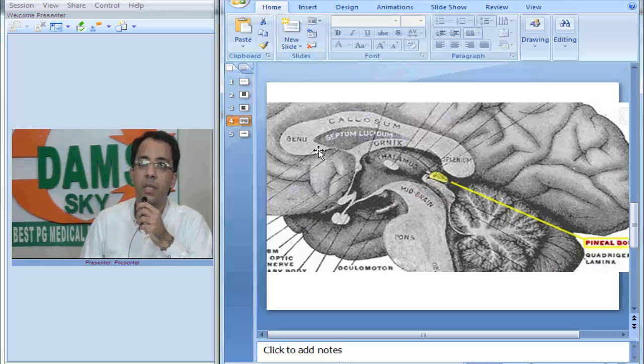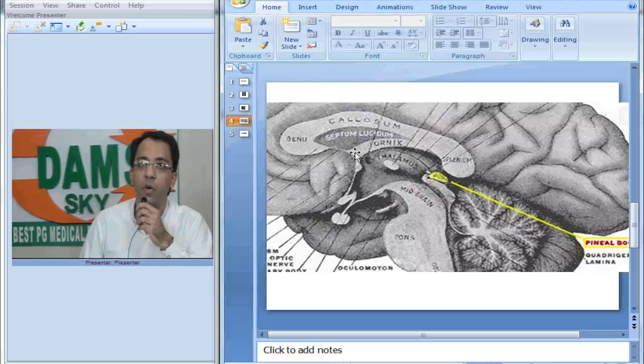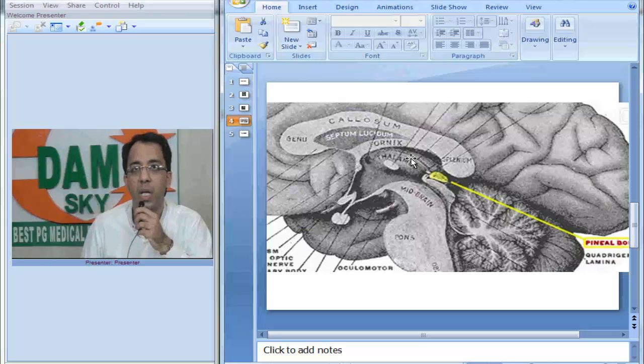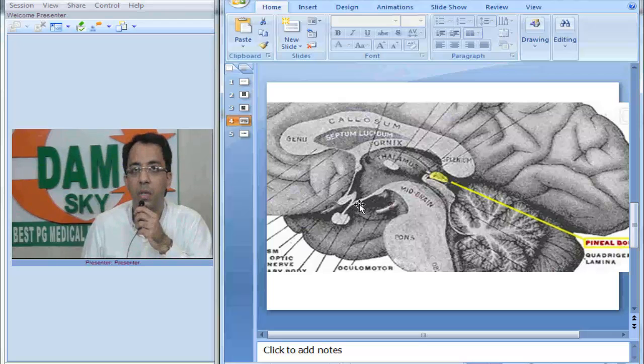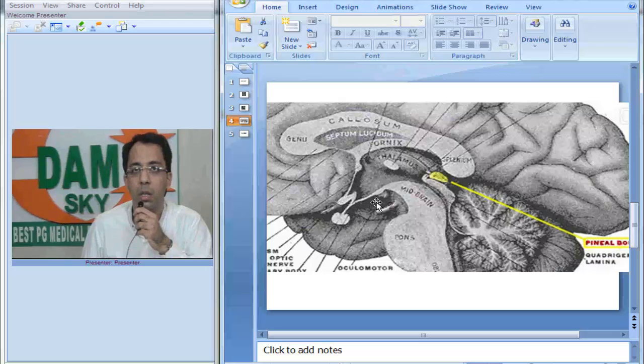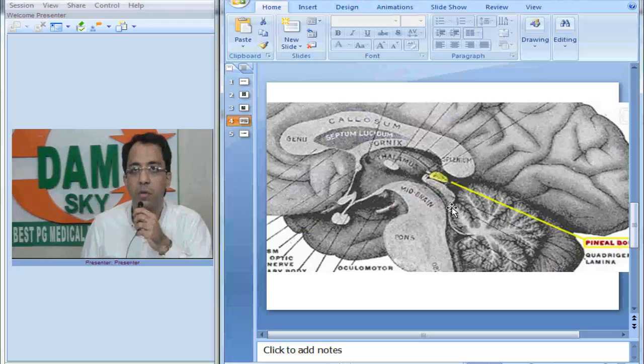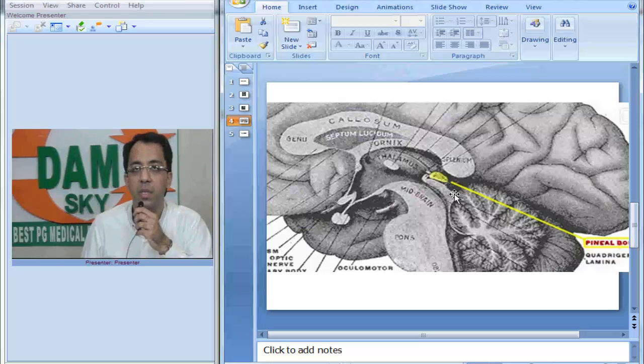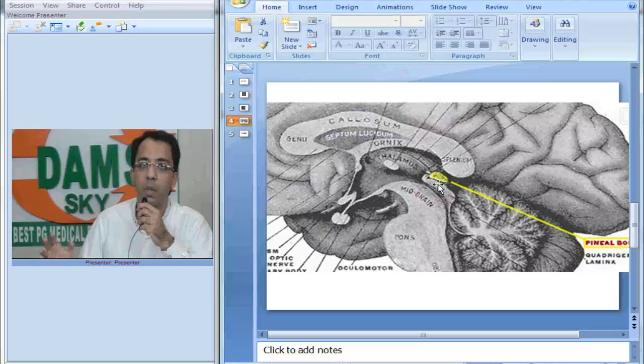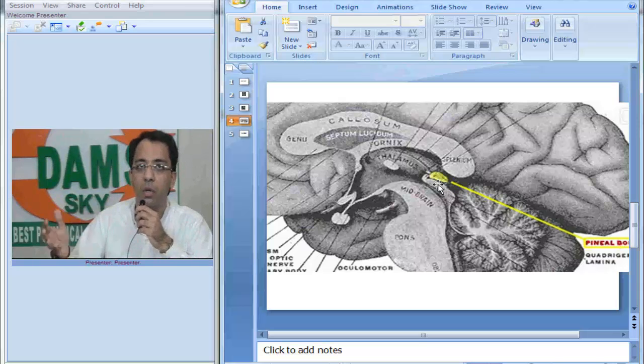This is the corpus callosum. This is the posterior part, the splenium. This is the fornix, area of the septum pellucidum, area of the thalamus. This is the optic recess of the third ventricle, infundibular recess. This is the optic chiasma, pituitary and midbrain, aqueduct of sylvius. This is the posterior part of the midbrain which is the quadrigeminal plate, which is the superior and inferior colliculi.